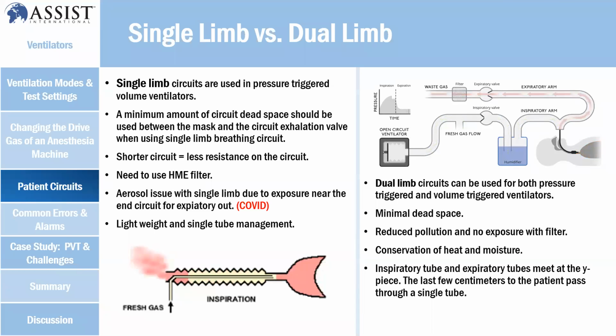If you look at the ventilator and patient circuit type, on the single limb system there will be an expiratory valve and an inspiratory valve, but the inspiratory line is one way, and the expiratory uses a small tube that does the measurement. In a single limb, there's another way: an intentional leak in the expiratory line. So what happens is you breathe, but at the same time there's a leak. Normally, you see this type of concept used in CPAP.